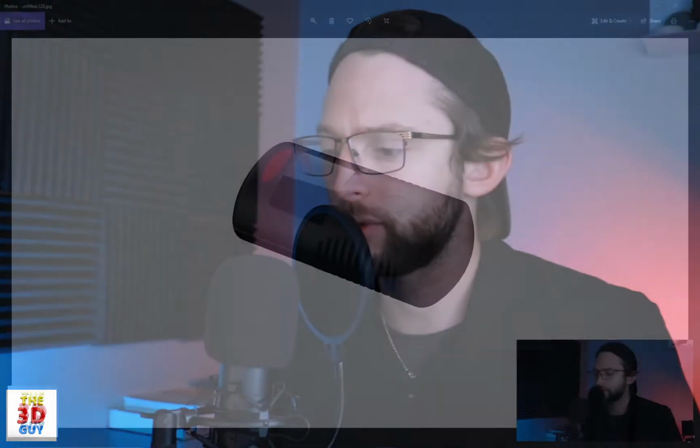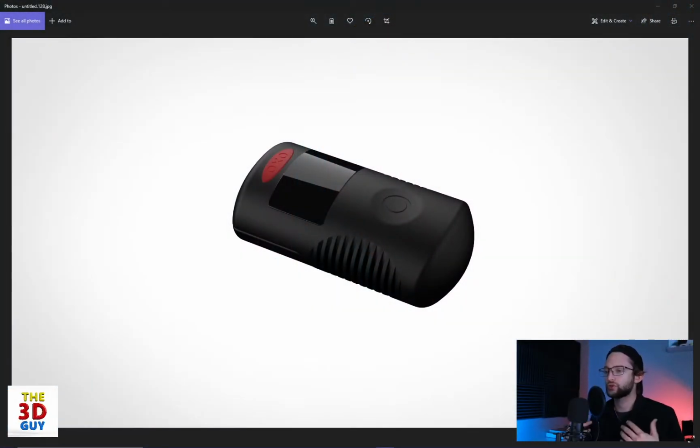Hey everybody, so this is the full length build of the pulse oximeter that I have been working on. Just as a reminder, this is just a concept. This is not anything that I'm actually working on for OXO or Target. It is just a concept idea that I've been toying around with, more just to practice branding and whatnot. Anyways, so this is just the basic shape.